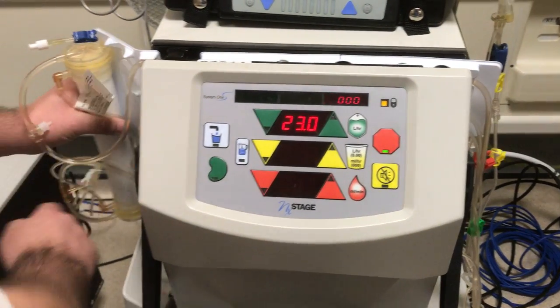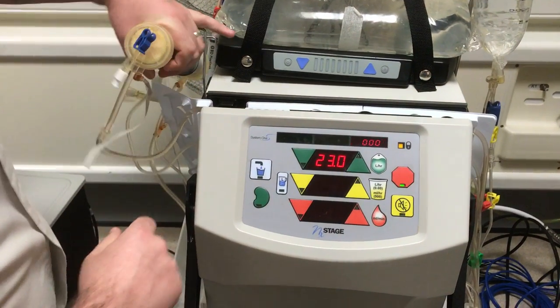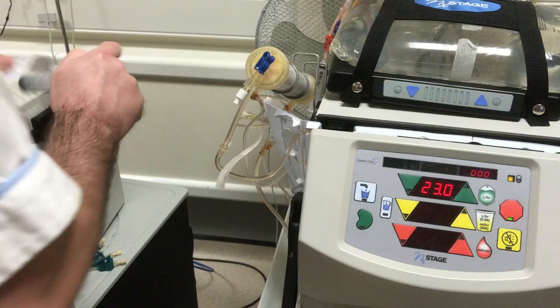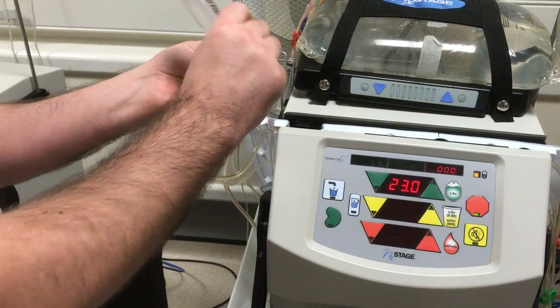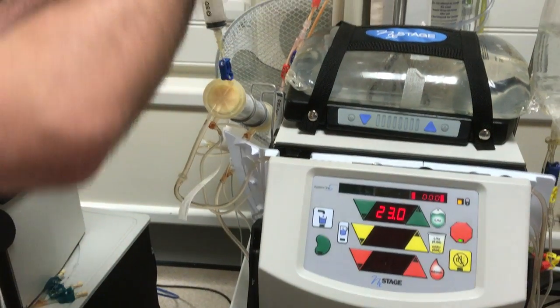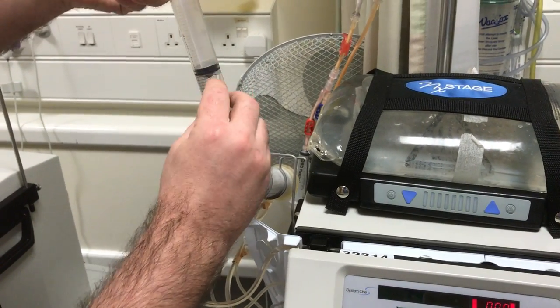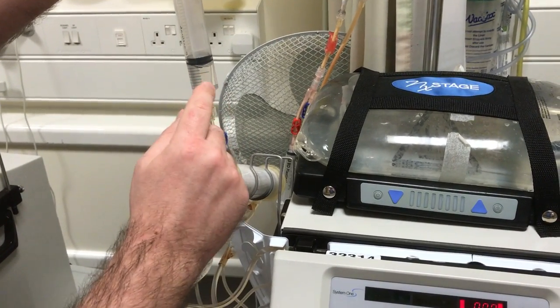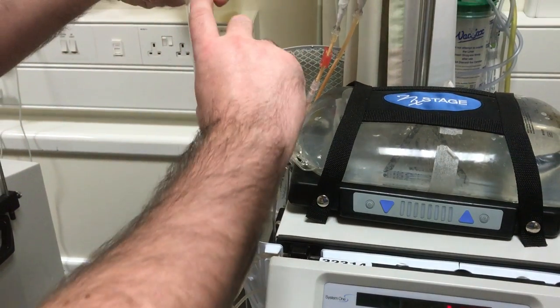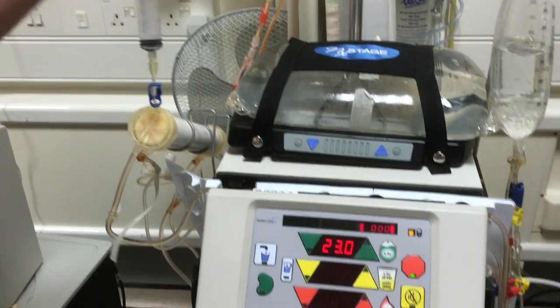We now need to take the dialyzer out of its holder and put it onto the top holder. We then need to get a 30 mil syringe, take the cap off the end of the dialyzer, put the syringe on, and we need to prime the air out of this part of the line. If you overfill the syringe don't worry, you can push the fluid back but leave the air at the top. You need to keep the syringe free so if you have any air problems later with the treatment you can deal with them with this syringe.